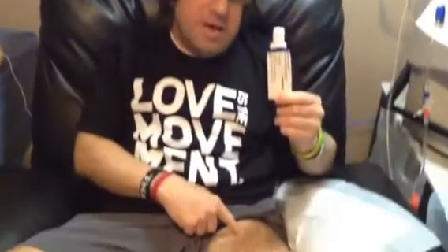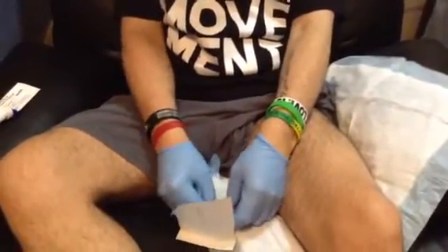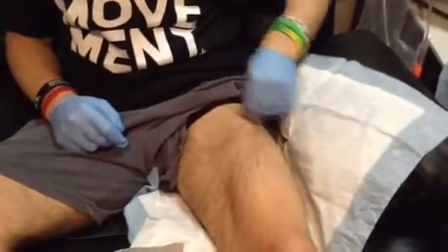Before I even started this, about a half hour ago I put on this numbing cream for my access in my leg. What I do is I pour some of this — it's like alcohol but even stronger, it's to sterilize the area — and I put it on these little 2x2 pads. I put on my gloves, and I wipe it around a little bit to sterilize the area.